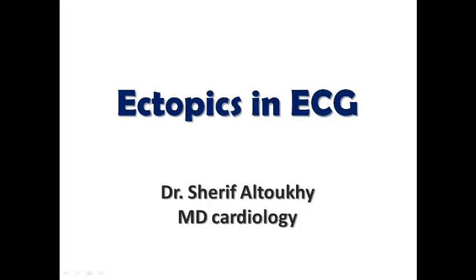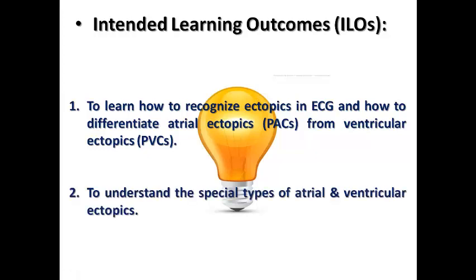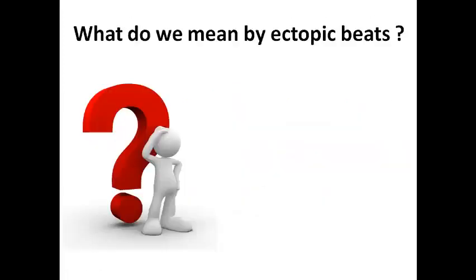in the ECG. Our ILO today is to learn how to recognize ectopics in ECG and how to differentiate atrial ectopics from ventricular ectopics, and to understand the special types of atrial and ventricular ectopics.